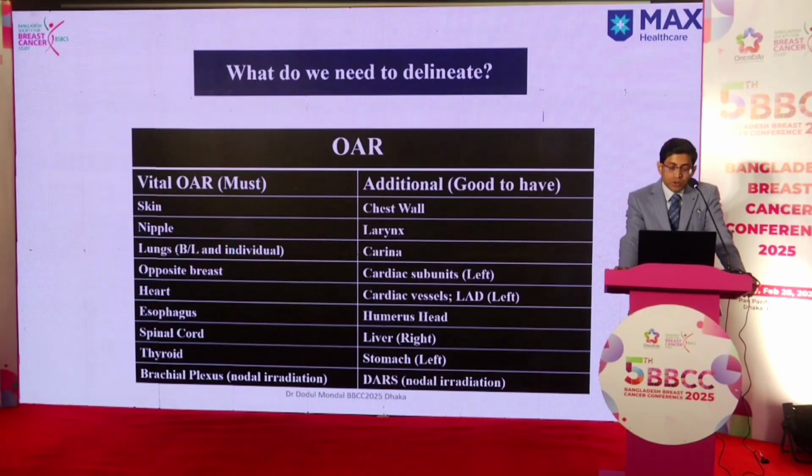For left-sided breast, we also contour the stomach, because we have also seen a lot of patients with significant dose deposited to the stomach when they are not optimized. And DAR structures for patients who are going to get SCF and axillary radiation.